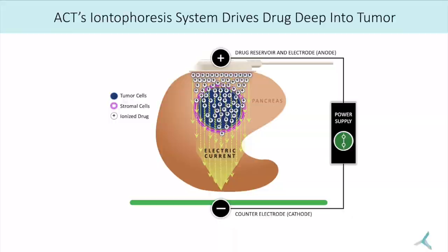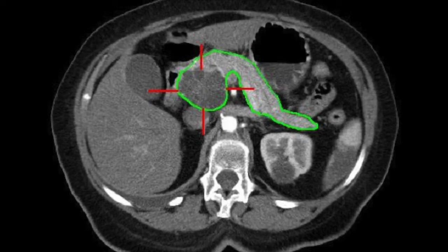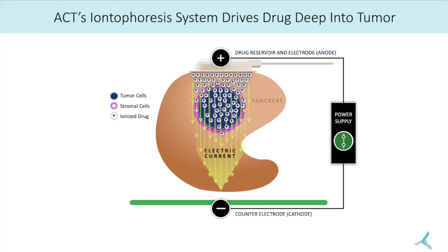A typical course of treatment would be weekly infusions for 8 weeks. When the treatment is over, the tumor would be re-imaged, and if the tumor is shrunk away from those blood vessels Jinjin mentioned, both the tumor and the device would be removed.